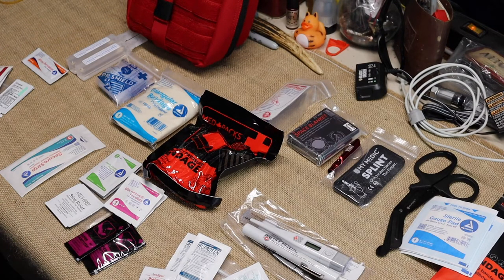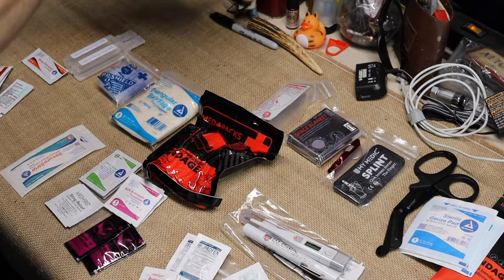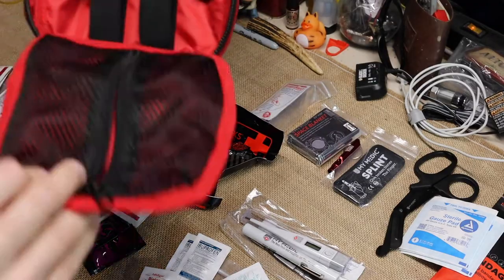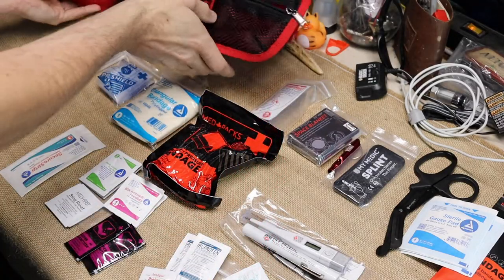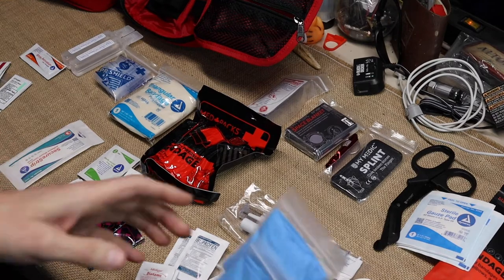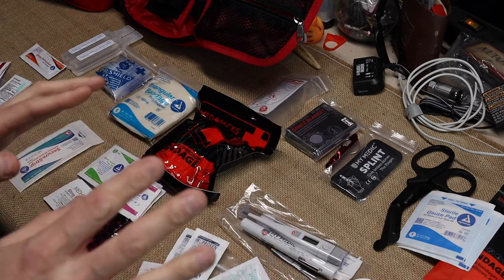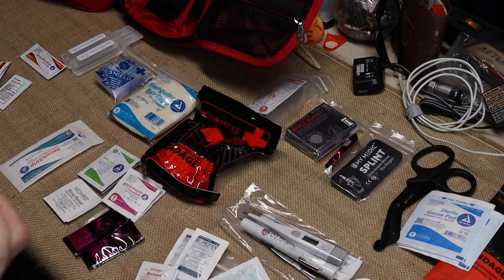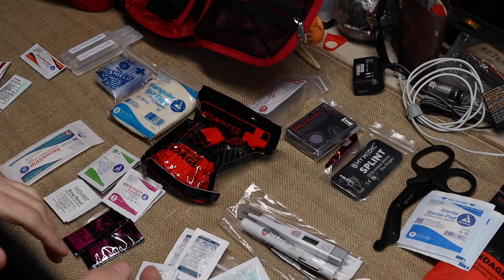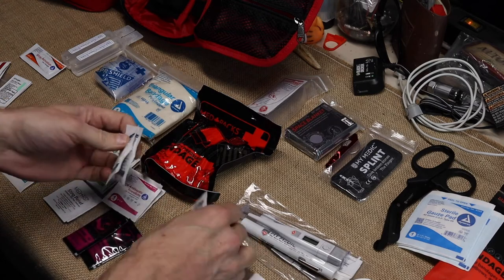I'm not talking about the med kits, I'm talking about the packs they have. We're going to start out with everything you would find in this little pocket here. First off, you will have two pairs of rubber gloves. If you treat anybody that's bleeding or anything oozing, you will need rubber gloves.